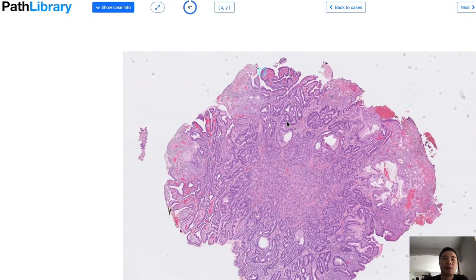So that's important to know that with hyperplastic polyps, you'll see inflammatory cells because it arises in a background of gastritis, and that can be due to H. pylori, that can be due to AMAG, and other types of gastritis. And so when you do see a hyperplastic polyp, especially if it's greater than 1 centimeter, you want to rule out dysplasia. You can have a hyperplastic polyp that does have dysplasia, right?